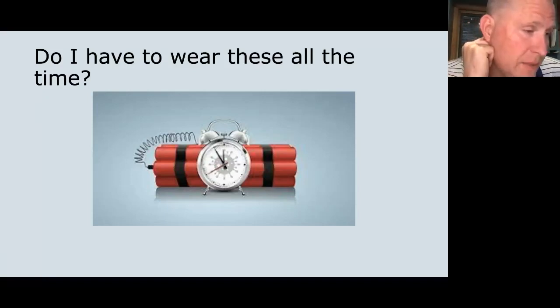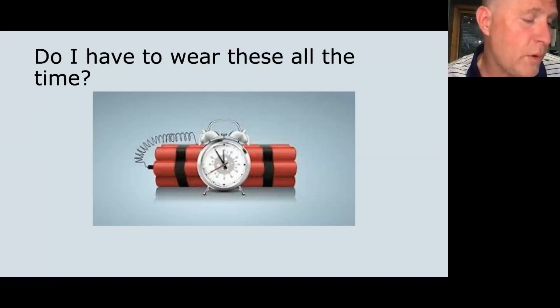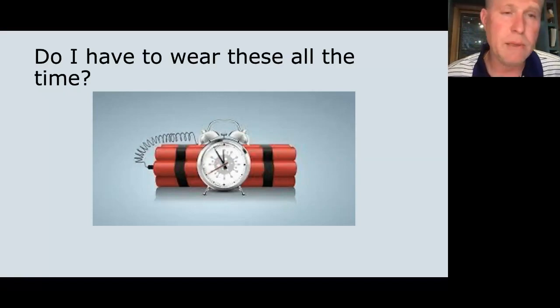No one's going to make you wear these, Mrs. Jones, and no, you don't have to wear them all the time. But my hope is that when you start using them, you'll want to wear them all the time. The last thing you want to do is tell a patient, a senior patient especially, that these have to be worn every moment of every day. If you do a good job of casting, getting these things in and shoeing them right, they'll want to wear them, unless they're just obstinate or they can't bend over or they can't put them on themselves. If they have to depend on a family member to put these on, obviously that's going to reduce your compliance and success rate. But the most important thing is, again, shoeing these things correctly to make them comfortable.